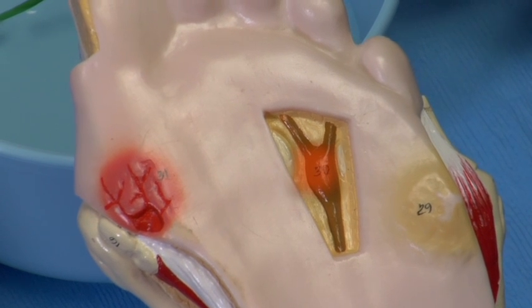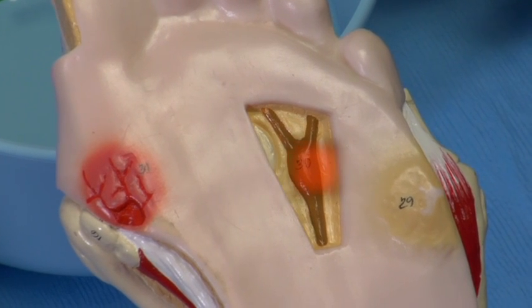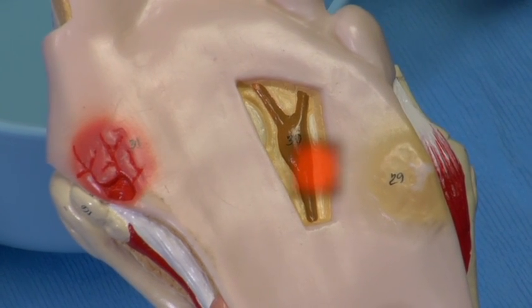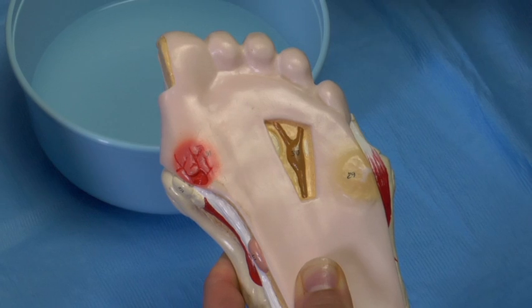Well, we've shown you if you have a high-quality diagnostic ultrasound, you can actually get right on the part of the nerve that you need to hit. But what most people don't understand until they actually see it is that the ice ball that's created with the probe is actually very thick.